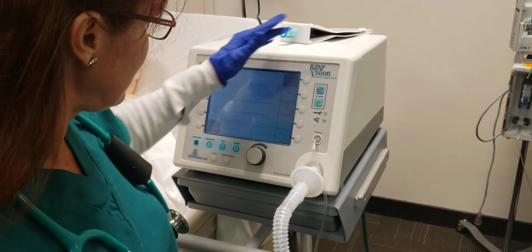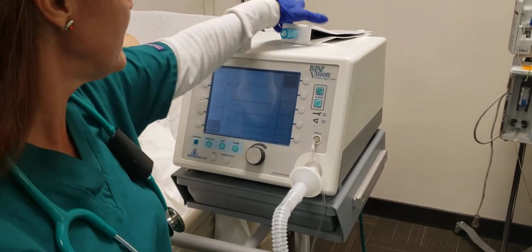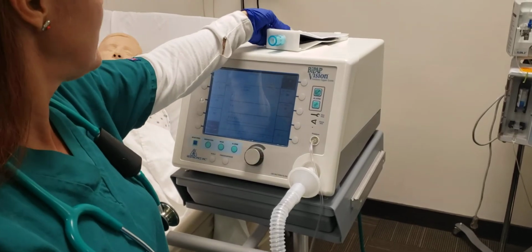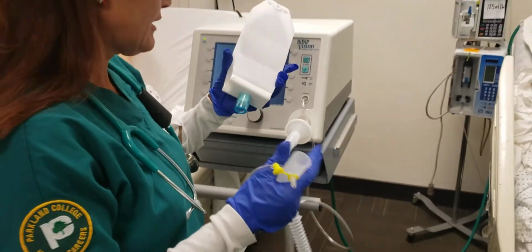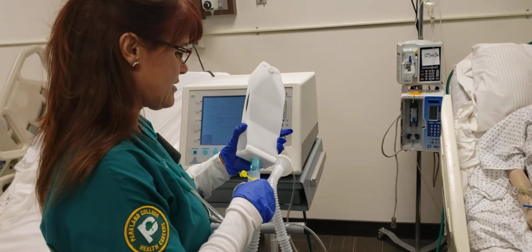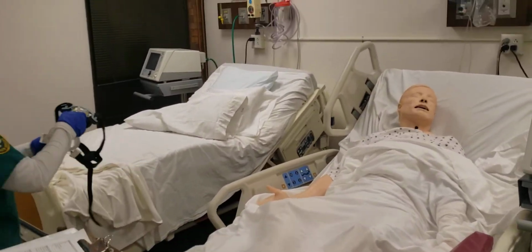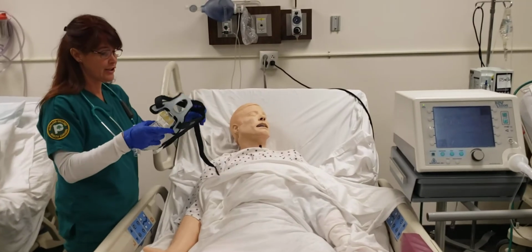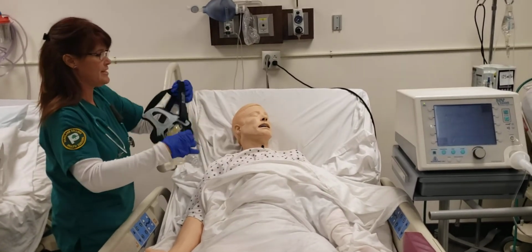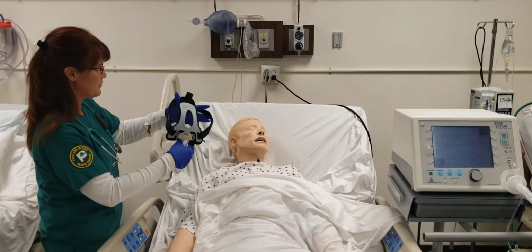So right now, I'm going to go ahead and up that a little so it's not going off while I'm getting the patient hooked up. So at this point, we would go ahead and get the flow going and put the mask on the patient. So we're going to pretend we got the flow to the mask. All right, so with these, you're better off to have them about ready to go so you can easily slip them over the patient's head and make sure they look in order so you're not fumbling around.